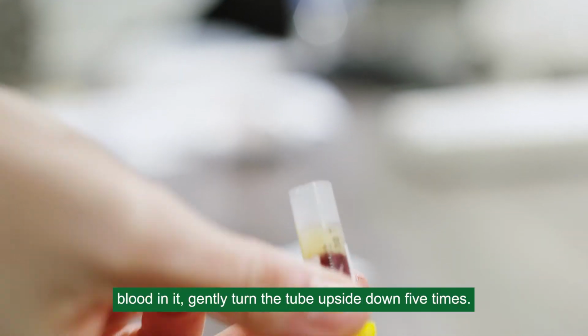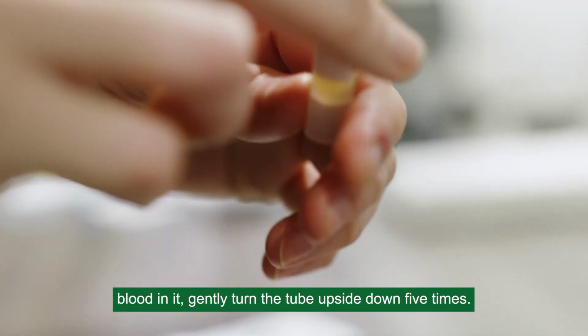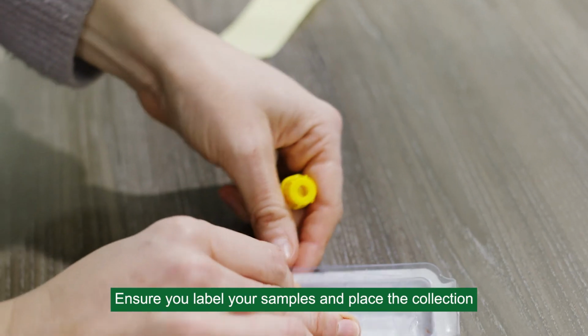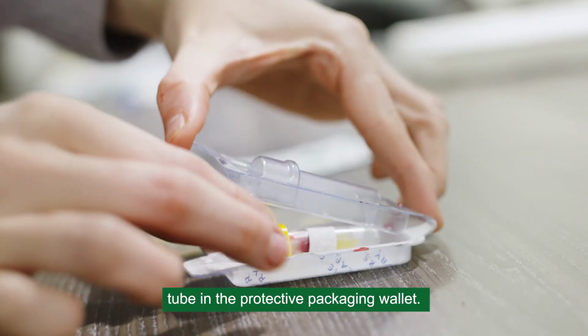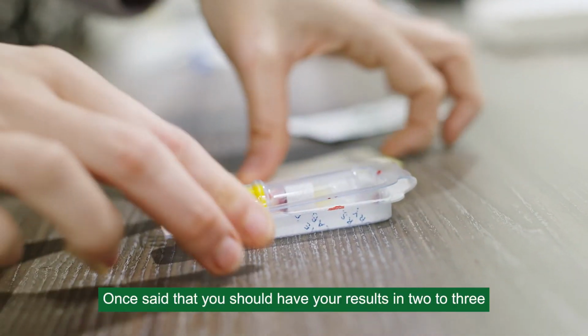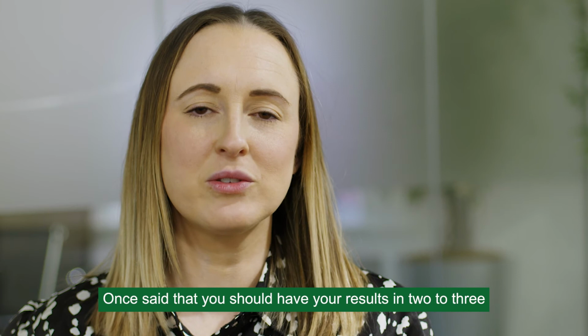Once the tube has enough blood in it, gently turn the tube upside down 5 times. Ensure you label your samples and place the collection tube in the protective packaging wallet. You can then send your samples off to the lab. Once they're there, you should have your results in 2 to 3 working days.